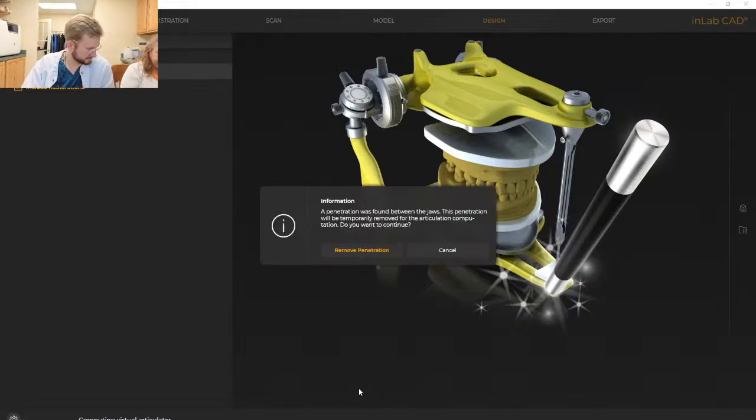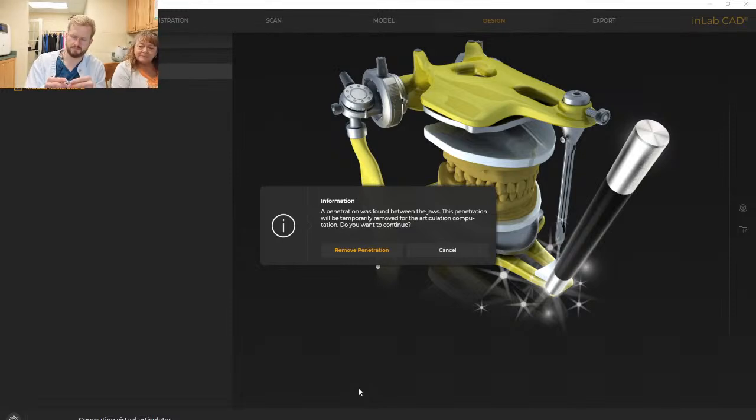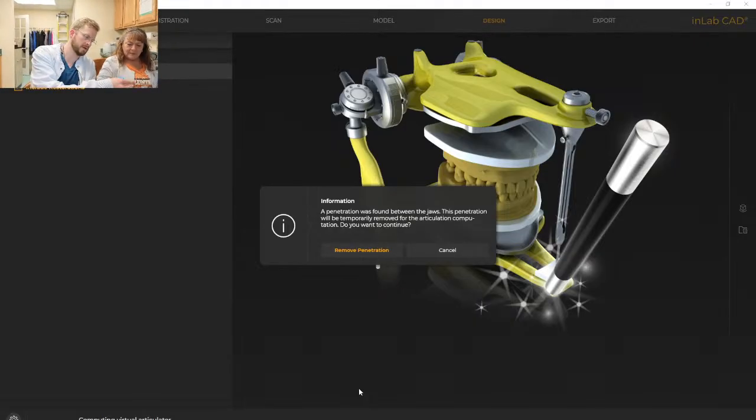How's the night guard look? You tell me. Yeah, there's two on both of them. You have those holes. It's just little dimples for her teeth. Mm-hmm. That's why I think she had sharp cusps. Roderick's here. Okay, thanks. Just right through here, just a little bit more, and then I'll be happy.